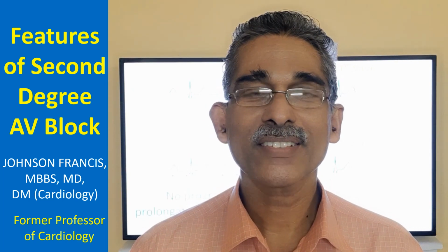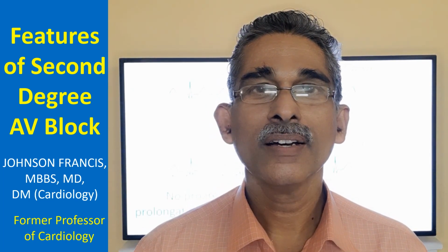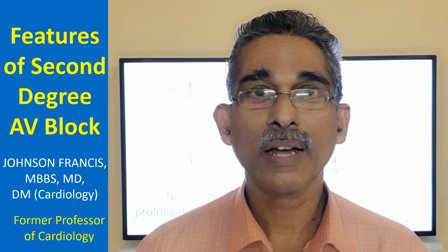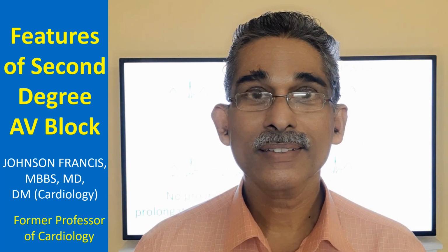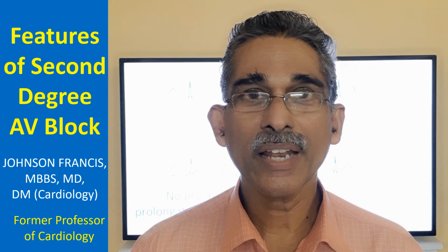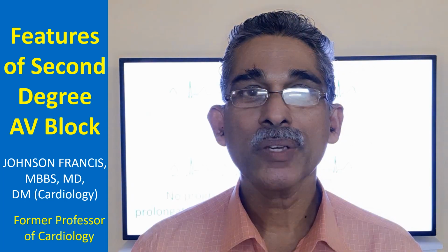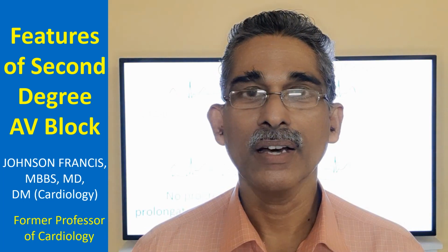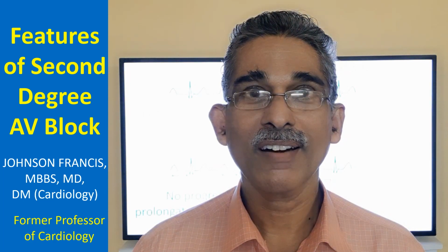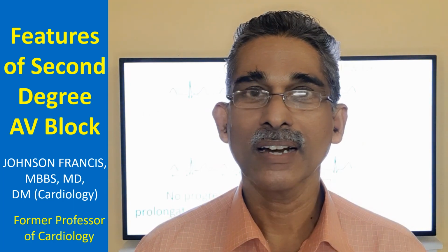Among the various grades of AV block, in first degree AV block and third degree AV block or complete heart block, the rhythm is regular. While in second degree AV block, the rhythm is always irregular. There will be a patterned irregularity mostly. And in usual second degree AV block, only one P wave is non-conducted in a particular cycle.